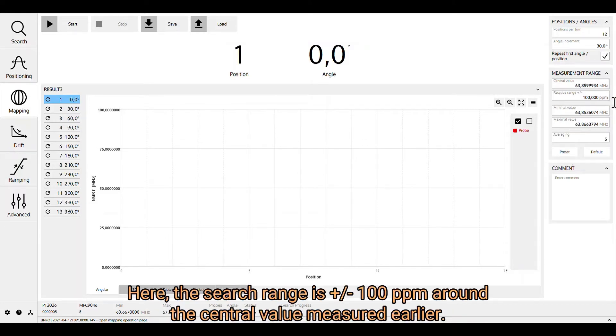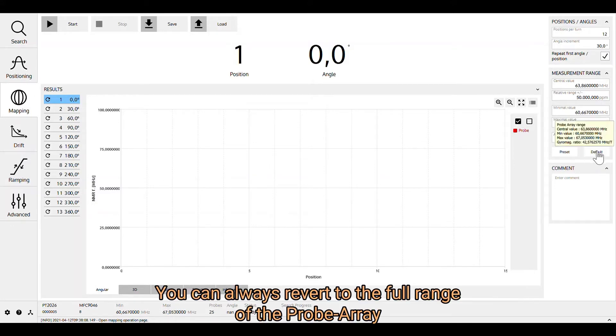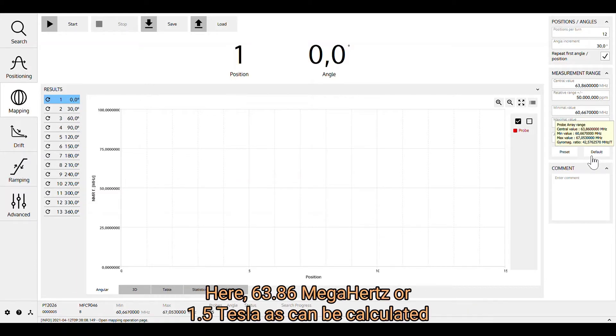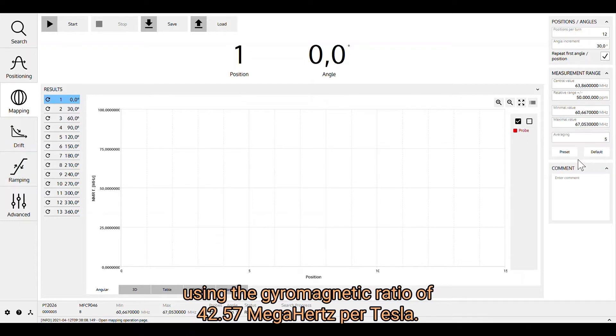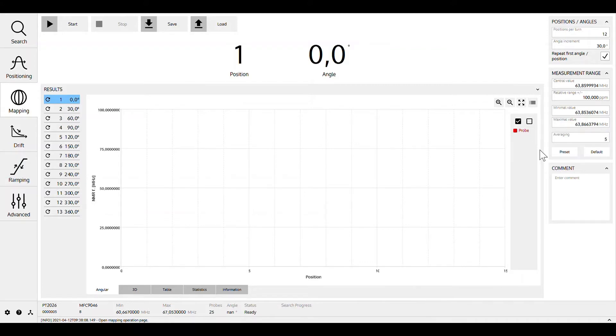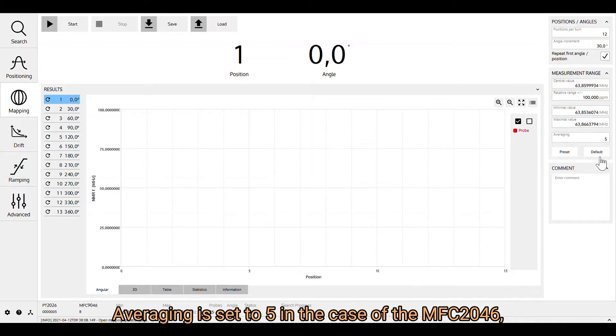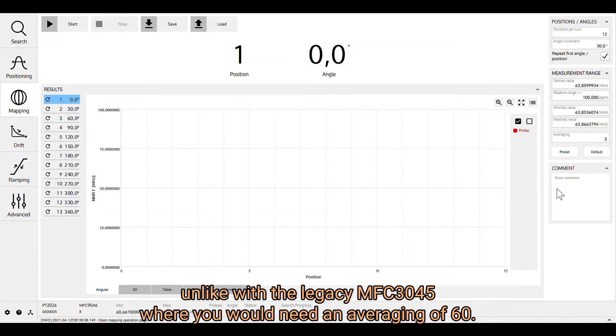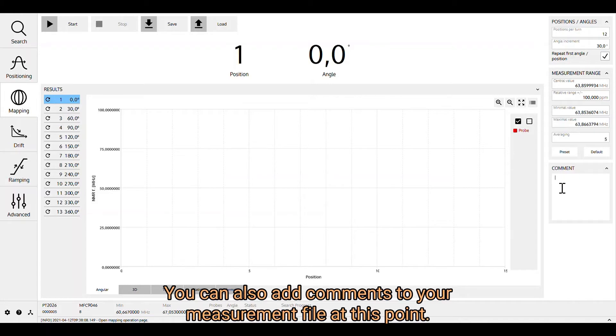The search range is plus or minus 100 ppm around the central value measured earlier. You can always revert to the full range of the probe array with a range of 50,000 ppm or 5% around the nominal value — 63.86 megahertz, or 1.5 Tesla, as calculated using the gyromagnetic ratio of 42.57 megahertz per Tesla. Averaging is set to 5 for the MFC 2046, which is sufficient for high accuracy with pulsed NMR technology, unlike the legacy MFC 3045 where you would need an averaging of 60. You can also add comments to your measurement file at this point.